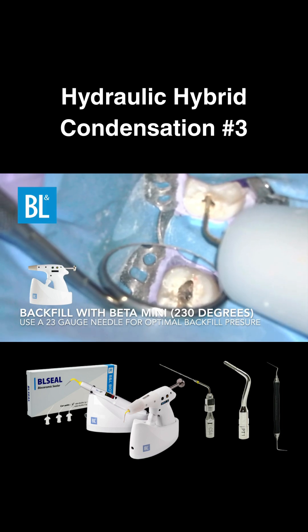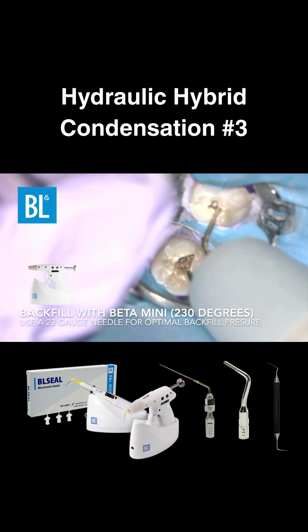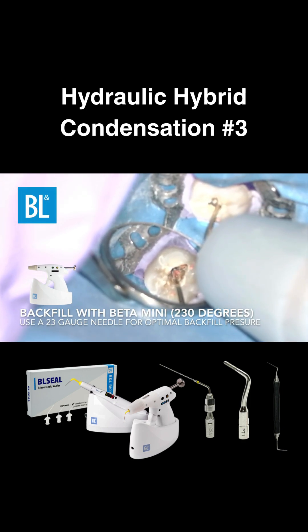I recommend a 23 gauge needle for optimal pressure and control. However, if you're working in a narrower canal or want to down pack deeper, a 25 gauge needle is a great alternative.